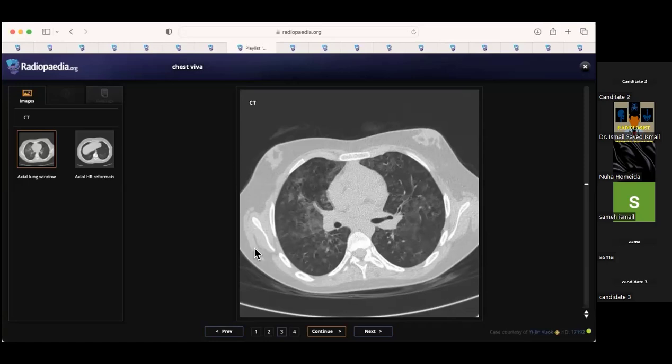So HRCT, as here, has features which are supportive of the diagnosis, and then they sit all together and discuss. So HRCT and then history of exposure. You need a history of exposure. And then they tend to do bronchoalveolar lavage, lymphocytosis, plus pathology. So the three features of HRCT with a history, as well as bronchoalveolar lavage and pathology, will give the diagnosis. So hypersensitivity pneumonitis gets referred to the interstitial lung disease MDT. We have an interstitial lung disease MDT here. They'll all sit together, so it's radiological as well as history, as well as bronchoalveolar lavage and pathology.